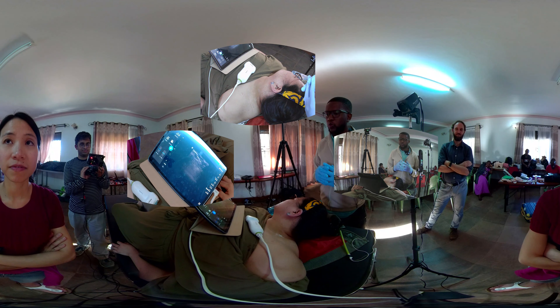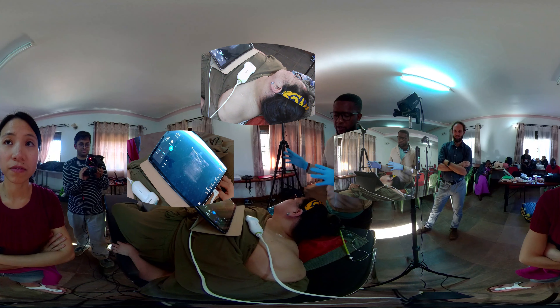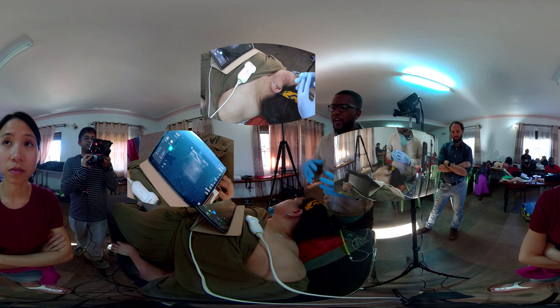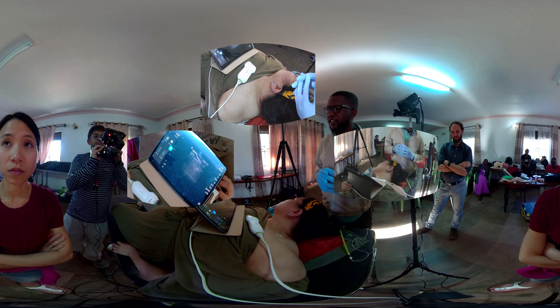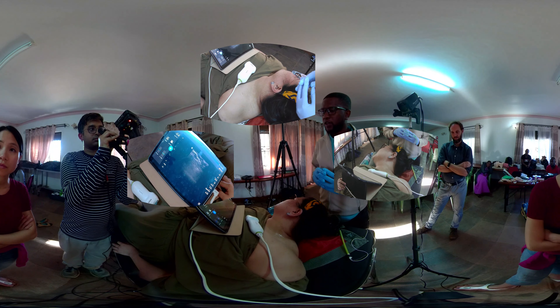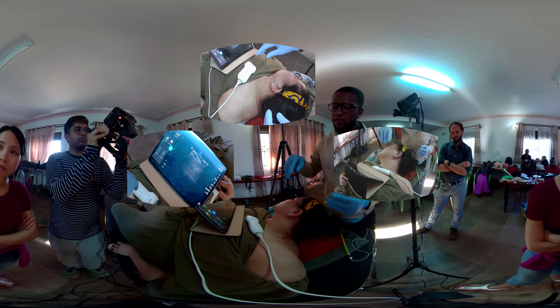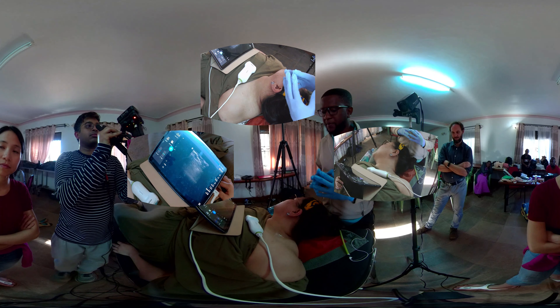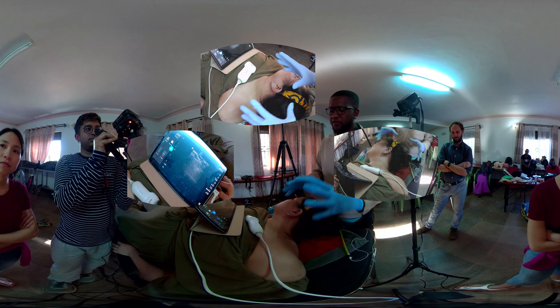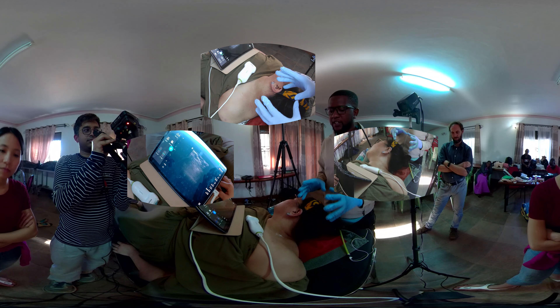You want your patient facing on the contralateral side, you want your screen directly opposite you, and for that you need a linear probe with a depth of about 3 to 5 centimeters. You also need a needle of length about 50 millimeters. Once the preliminary is done, you've got your local anesthetic, and you have cleaned the patient in a sterile manner.